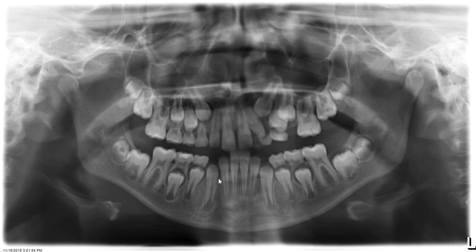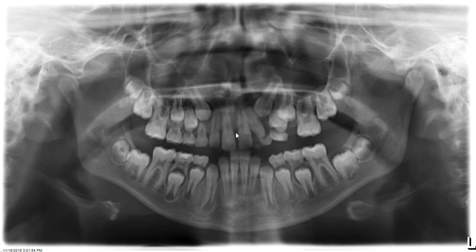Let's recognize what teeth have erupted so far. Maxillary and mandibular first molars are erupted, mandibular incisors are erupted, canines are in the process of erupting. Looking over to the maxilla, central incisors are erupted, number 7 is erupted — now let's take a look at number 10.